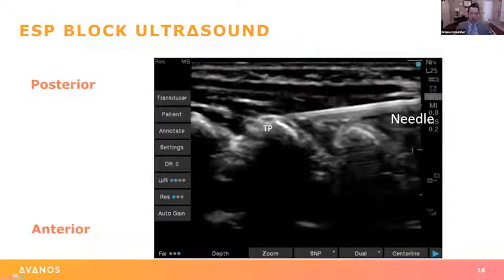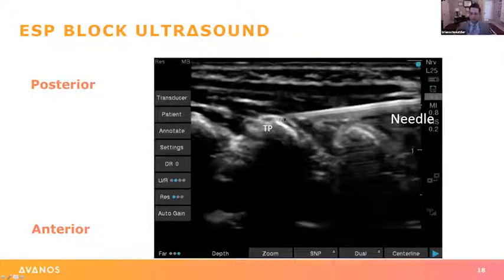Here is another ultrasound picture — needle coming through, touching the tip of the transverse process right underneath the erector spinae muscle.